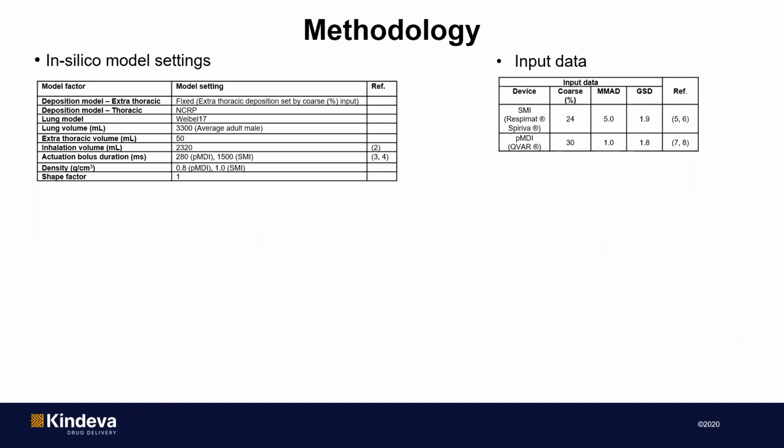In terms of the model setup then, that was based on advice from the supplier, but also a significant amount of literature publications. Coarse deposition for the extrathoracic region was determined from in vivo studies of the Respimat and QVAR products.